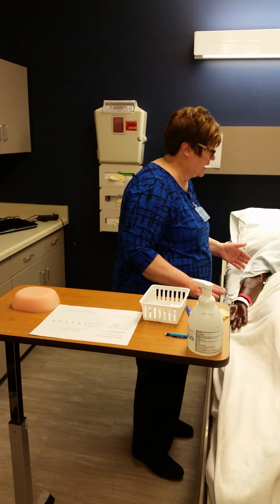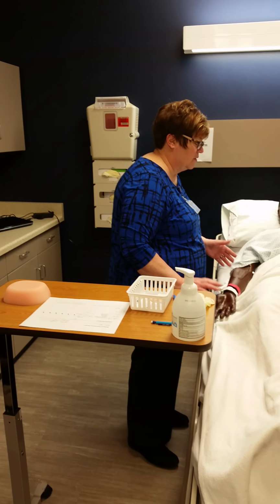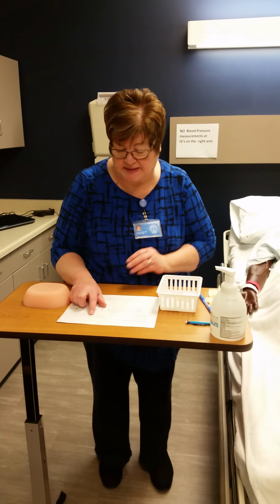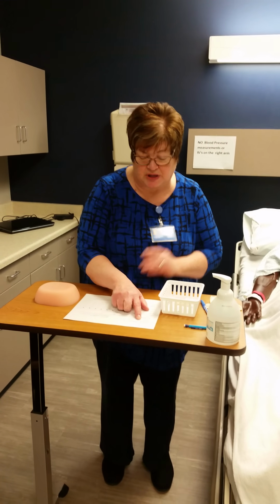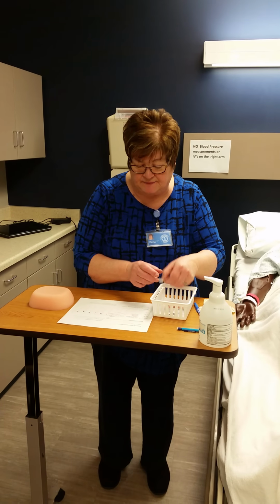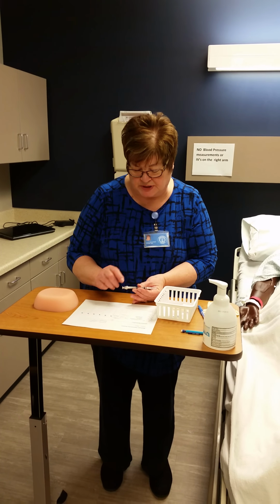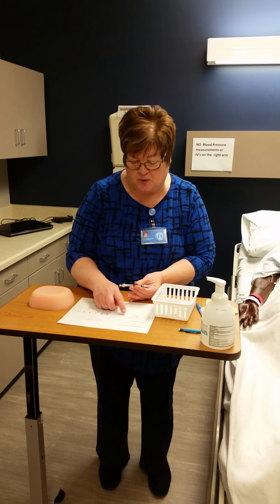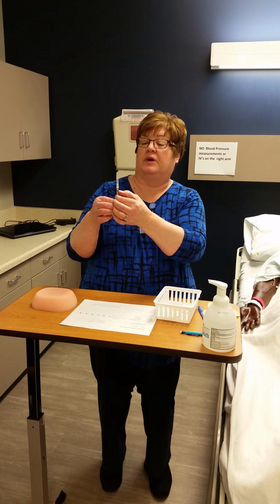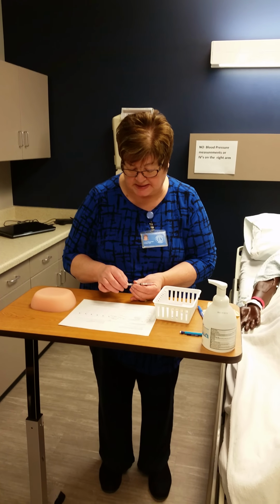Okay, so I'm just going to check, make sure I've got the right medication for you, and then I'll start evaluating your skin, okay? So back to my MAR here. We have Casey Banks, 10-2-1965, has an allergy to aspirin, which we have confirmed against his ID band. We have Tubersol, intradermal injection today only, 0.1 mil. To be given at 0900, and it has not been given on today's date.